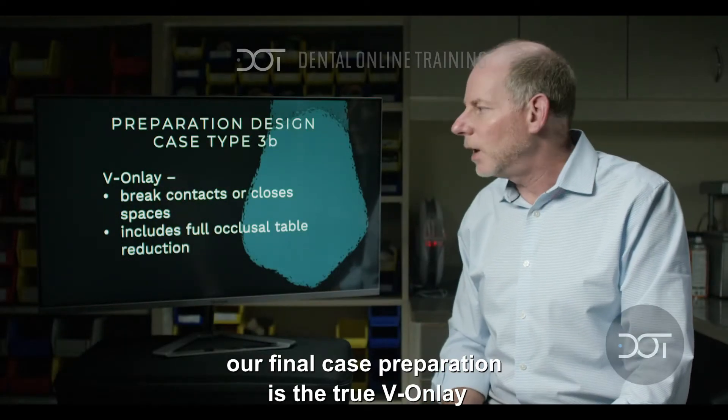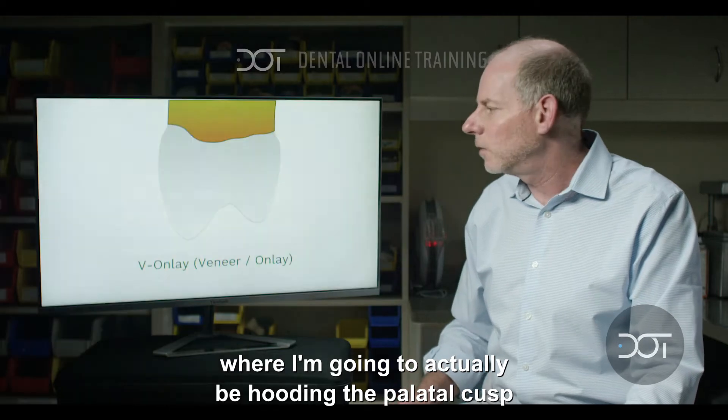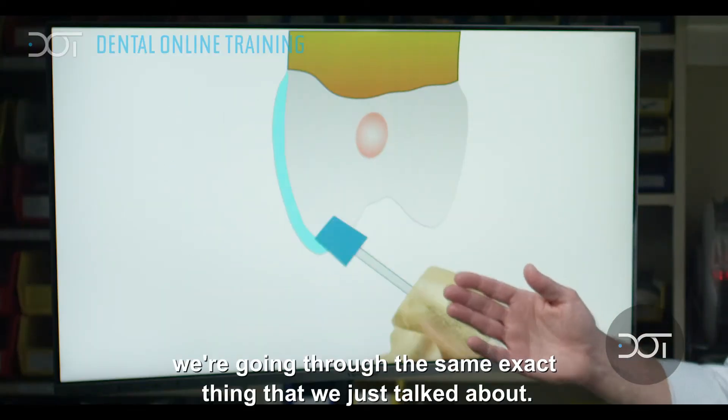Our final case preparation is the true veneer onlay where I'm going to be hooding the palatal cusp. So how's that look? We're going through the same exact things that we've just talked about.